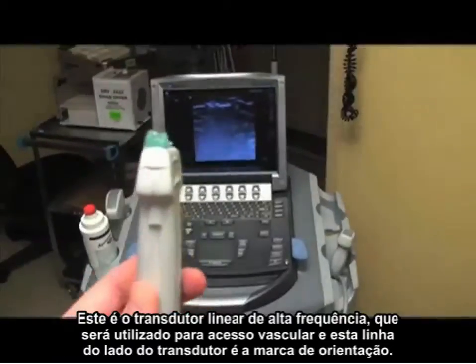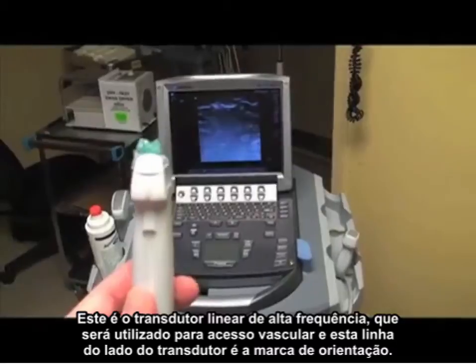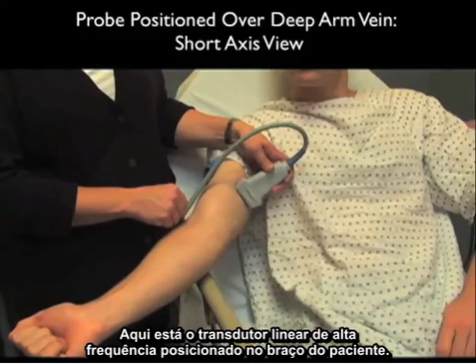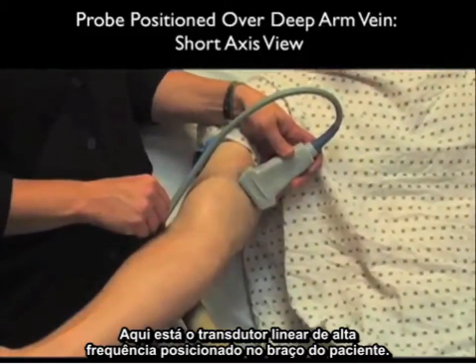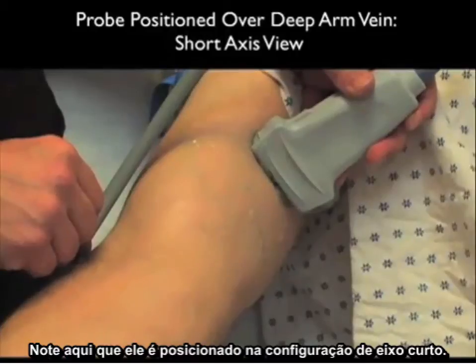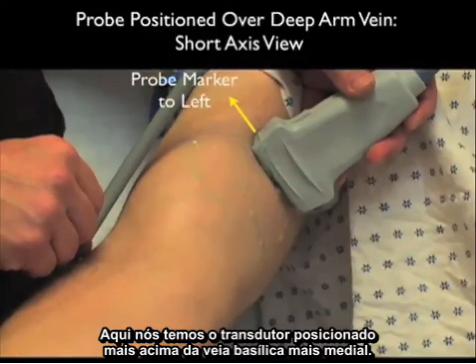Here's the high-frequency linear array probe that we'll be using for vascular access, and that line on the side is the indicator marker on the probe. Here it's placed on the patient's upper arm in a short axis, or side-to-side configuration, positioned over the more medial basilic vein.